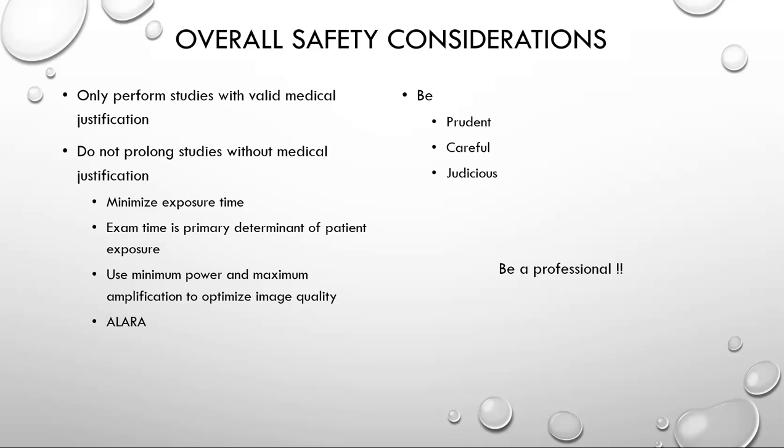Overall safety considerations are to only perform studies with a valid medical justification. Don't prolong the study without medical justification. Minimize the exposure time. Minimize the power and maximum amplification to optimize the image. Always practice ALARA. Be prudent, careful, and judicious. Be a professional.